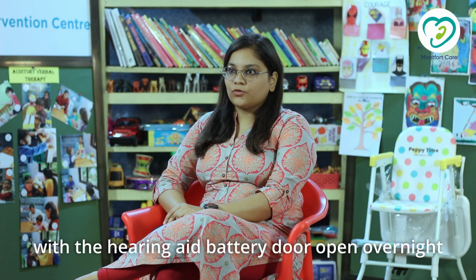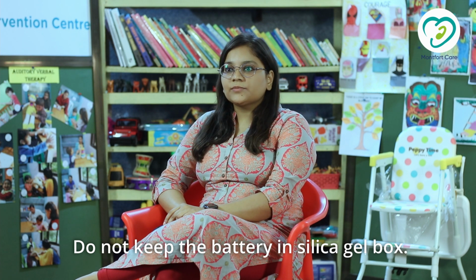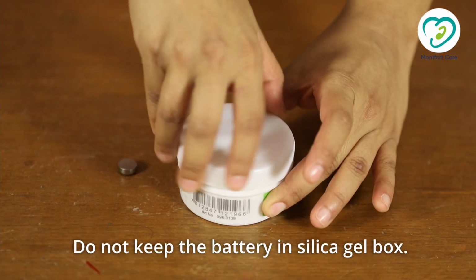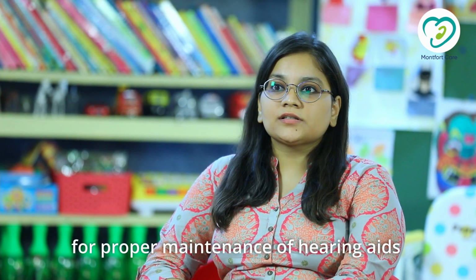Keep the hearing aid in the silica gel or dry aid box with the hearing aid battery door open overnight or when the hearing aid is not in use. Do not keep the battery in the silica gel box. Scheduling routine checkup with your audiologist for proper maintenance of hearing aids is essential.